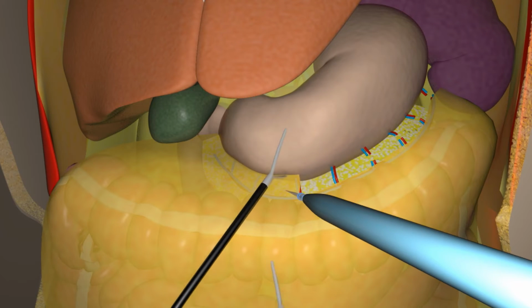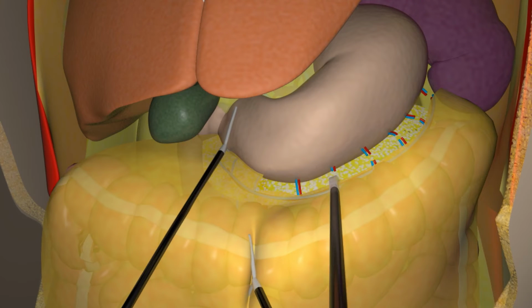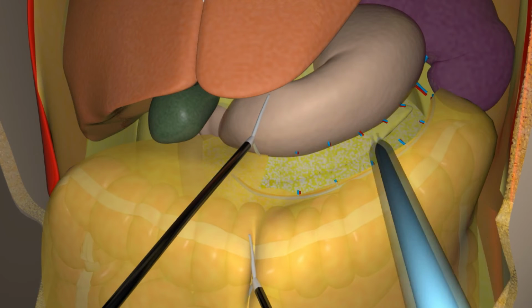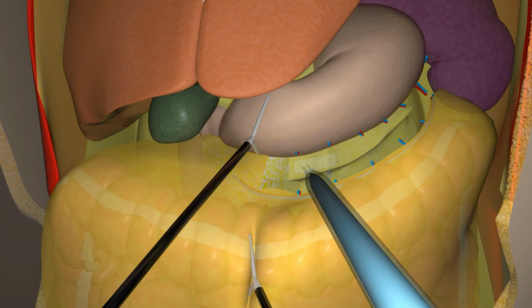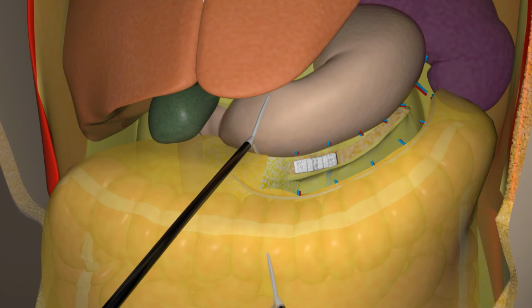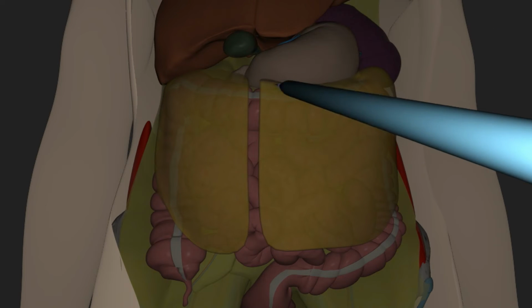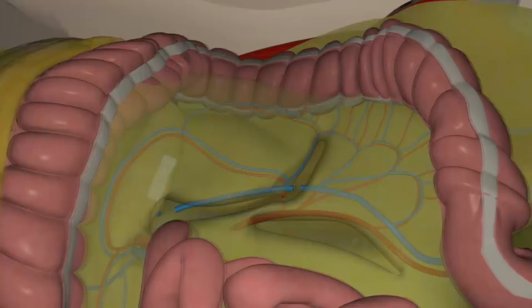Once this layer of peritoneum has been opened, one immediately enters into the lesser sac. The sponge that was placed previously, from the prior mobilization of the transverse mesocolon, can usually be seen in this area. Lymph nodes on the lower border of the pancreas must be removed at this location. The left side of the omentum is also included in the complete mesocolic excision specimen.